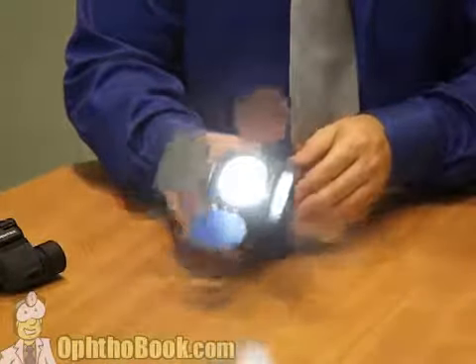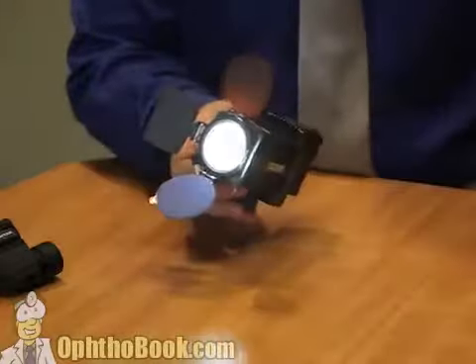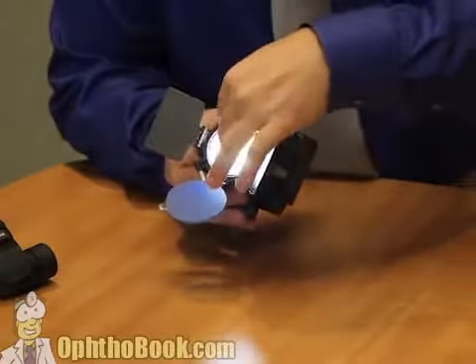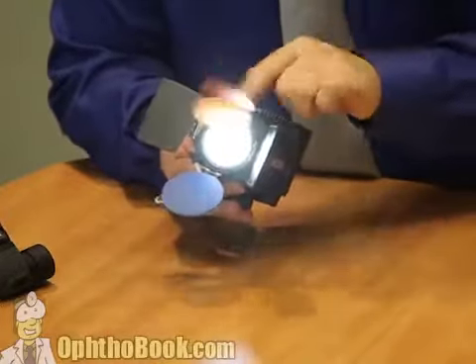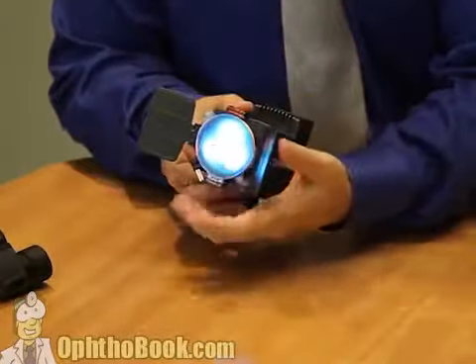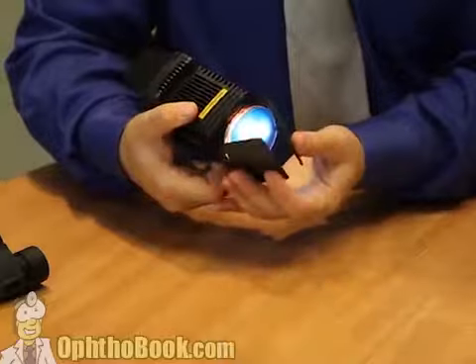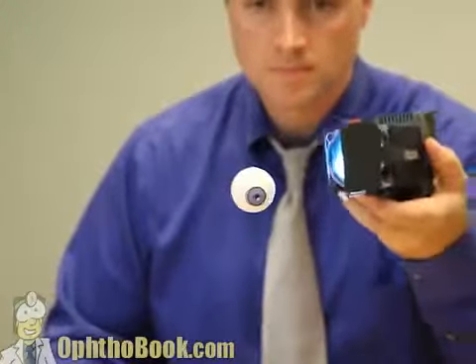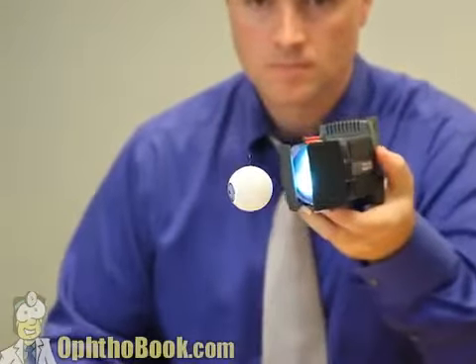But what if we improve our light, put it in some type of housing so that it's very bright? In fact, we can even focus our light using a lens in the front. We can add some filters onto the light in order to look at different structures in the eye. And we can even put barn doors so we can create a slit of light, a beam of light. And this is a better way to look at the eye. And now we have basically an excellent light source.